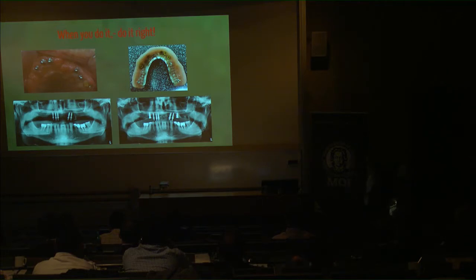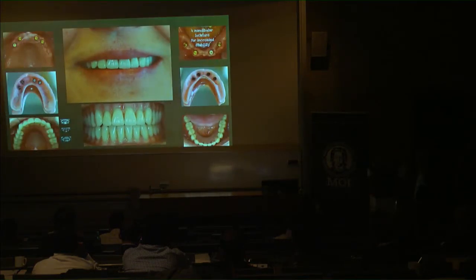And you wonder, why didn't he put those in the first place? But once they're healed, we'll probably cover up the middle implant here and do 6 locators here and a new implant-supported overdenture. And then we will have a look into this tooth. This is pretty much the protocol at our practice today. We do 4 implants in the upper, place the posterior implants as posterior as we can, and 4 in the lower.